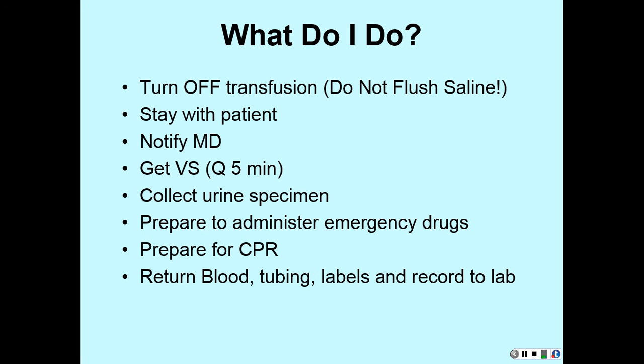And you're always going to make sure that your blood, the tubing, the labels, everything is returned back to the lab so that there can be some testing done on that unit of blood to see why that patient reacted. Everything is taken down and sent back to the lab.